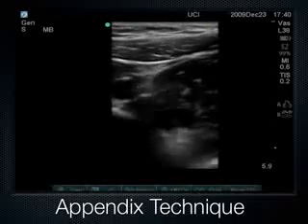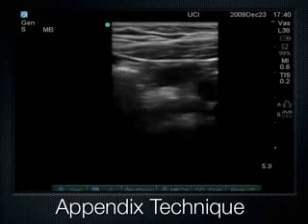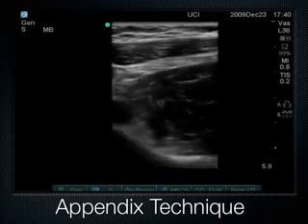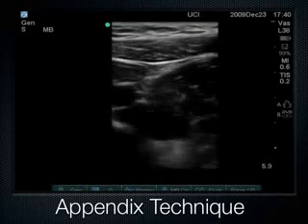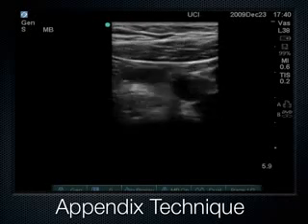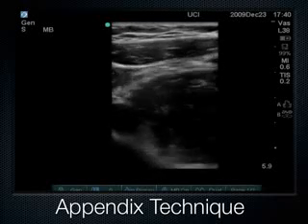So this is kind of what we do. Here's the abdominal wall musculature up here. Here's the loop of bowel right there, okay? This is the iliac vessel right there. And what we're doing is we're pushing really hard. So this muscle right here, this is the psoas muscle. The psoas muscle is actually coming up and coming into contact with the abdominal wall musculature right there. And there are loops of bowel that get sandwiched between the psoas, which is a very long muscle. The psoas sandwiches the bowel.